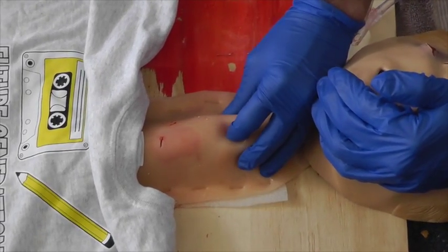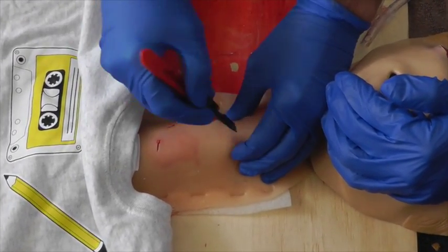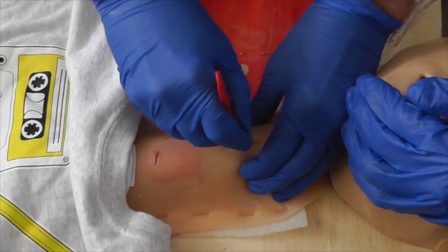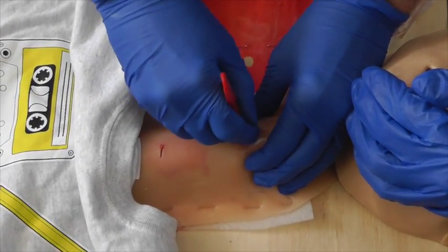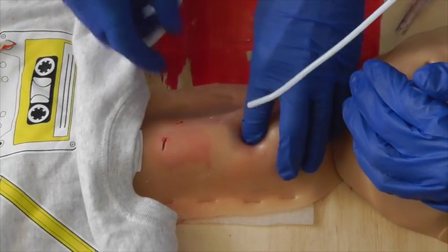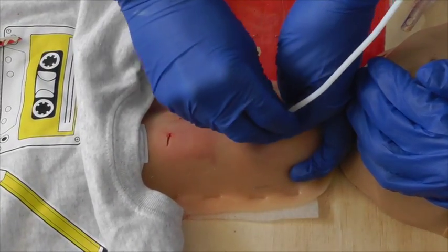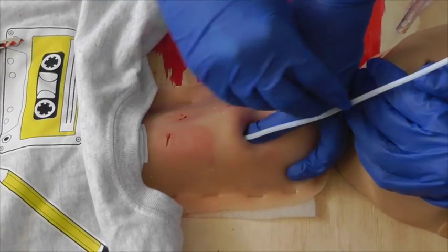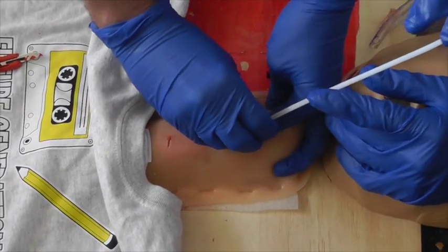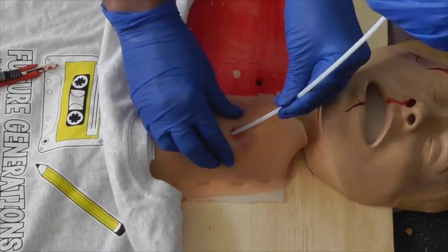Grabbing the larynx, identifying the cricothyroid membrane — there it is. I'll make a stab and rock incision through the membrane. Fingers going in — I can feel tracheal rings. Bougie through, please. Bougie's against the finger; I can still feel tracheal rings. Finger coming out — tube over the bougie, please. Tube's coming down.